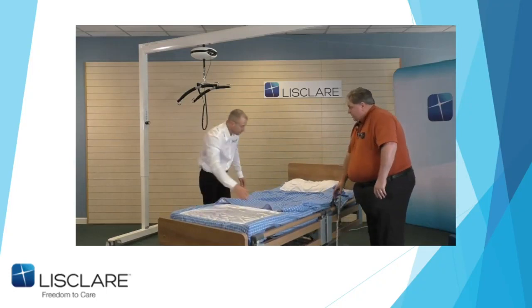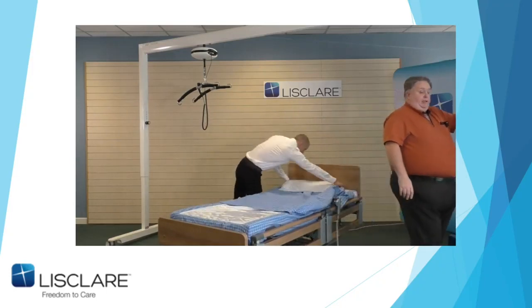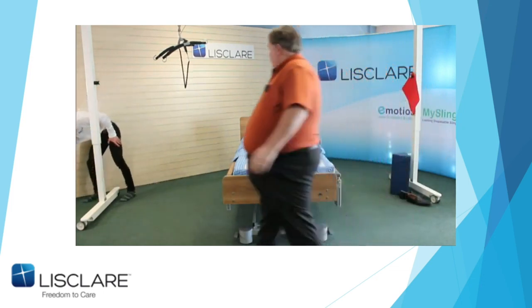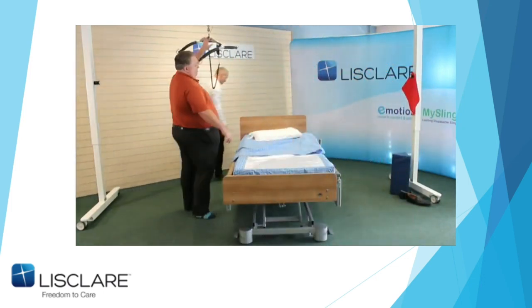Now, what we're going to use now is the gantry for this, because obviously my body mass is slightly more than John's. I'll just leave my socks off for this one, my shoes off. Yes, stripy socks. And if John goes round to the far side, I'll pass him over his hoist.